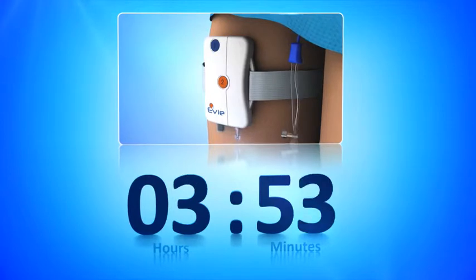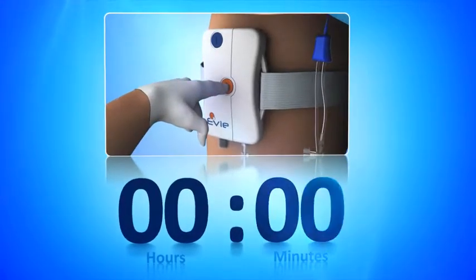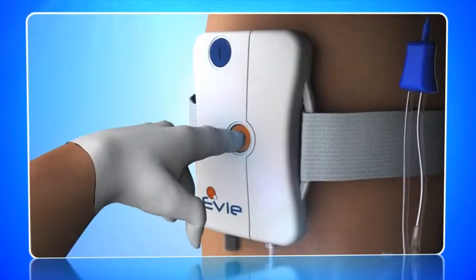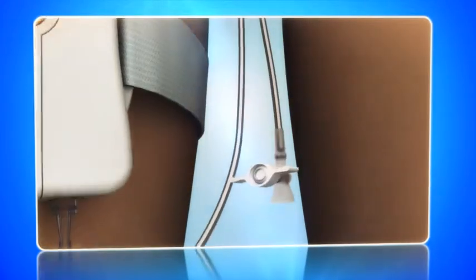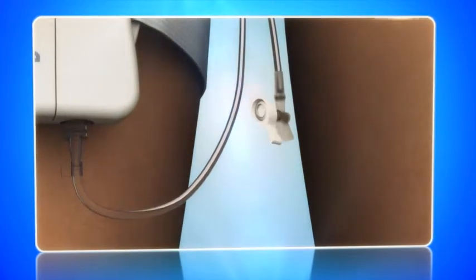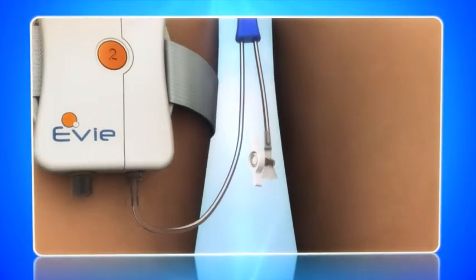After 4 hours, push button number 2 firmly until it moves inward. Make sure that the button remains depressed for a few seconds. Before withdrawing the catheter, the balloon must first be deflated by opening the stopcock on the catheter, as withdrawing the catheter with an inflated balloon may cause pain.